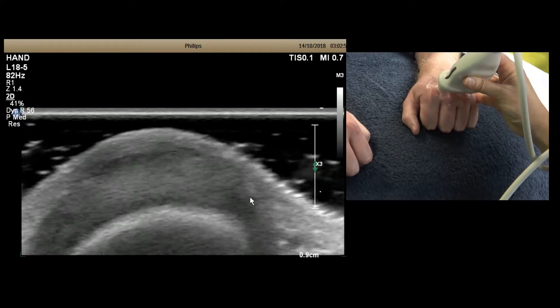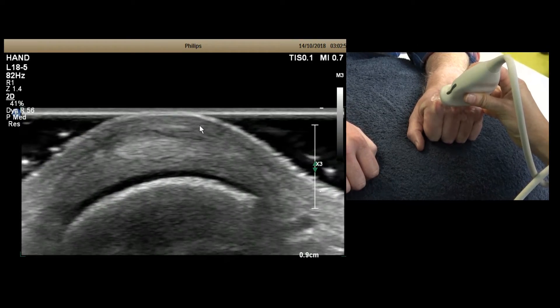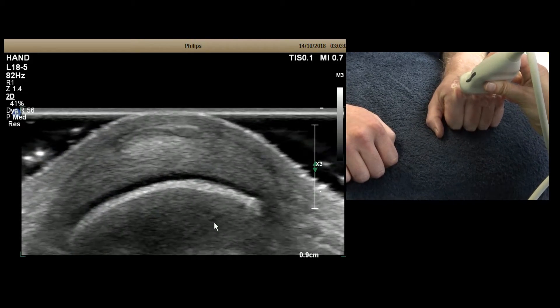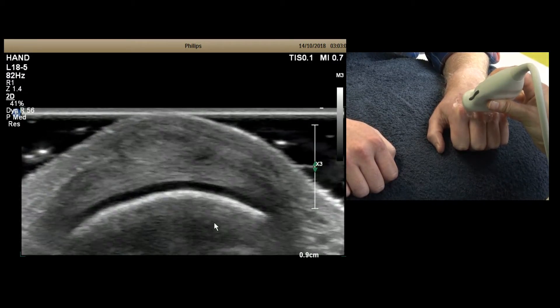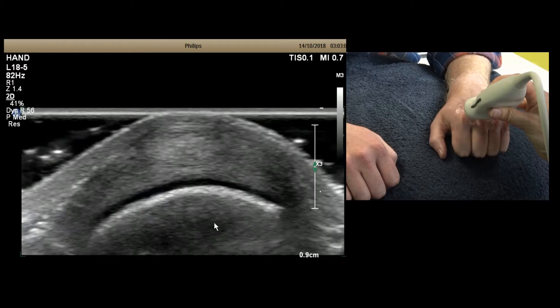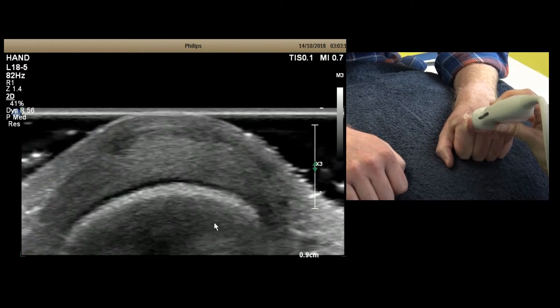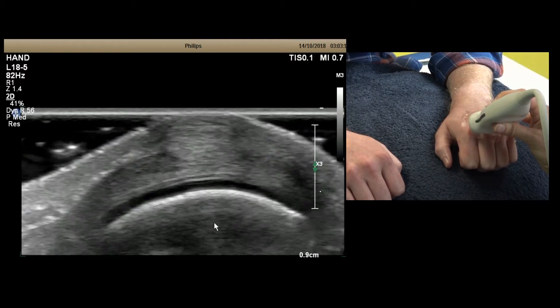Now you can see the sagittal band over the top, and the tendon has stayed centrally placed. Then ask the patient to slowly relax, and then squeeze tight again really tight — and then relax. This squeeze-and-relax cycle lets you dynamically assess tendon stability.